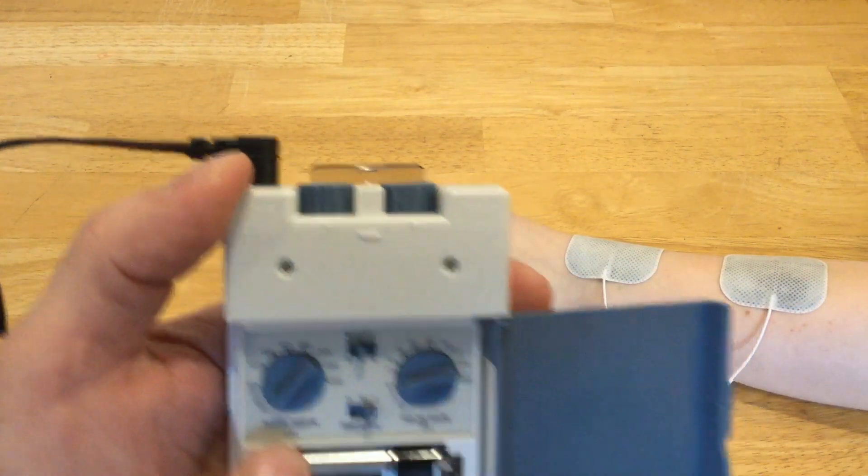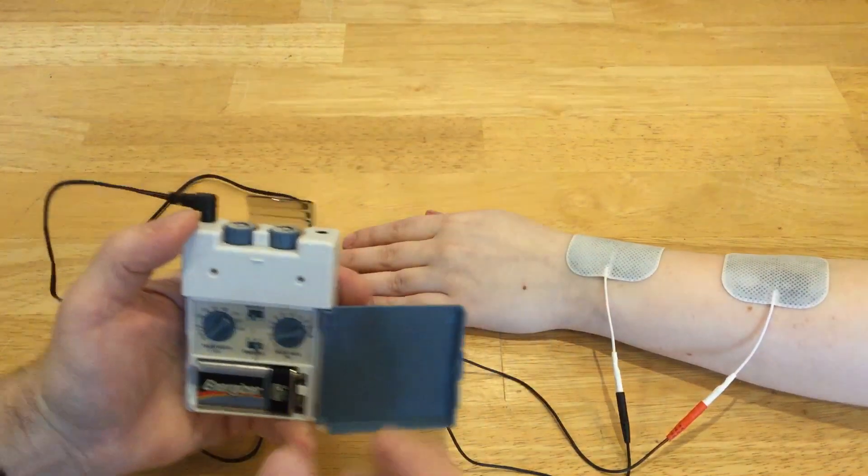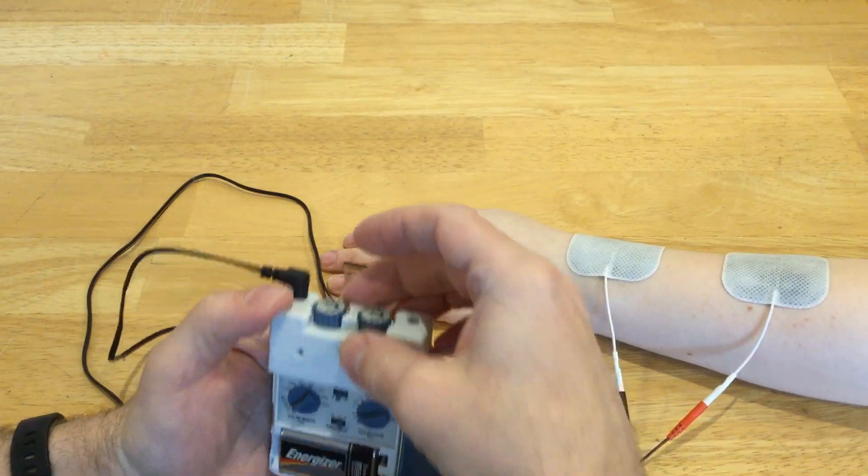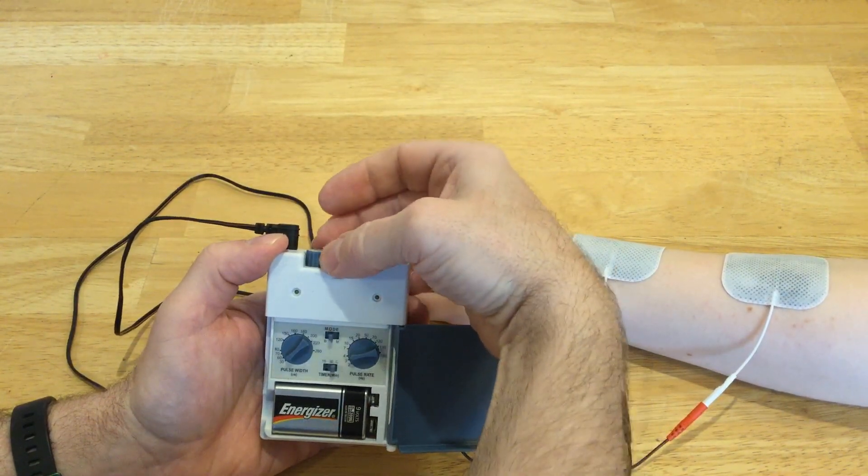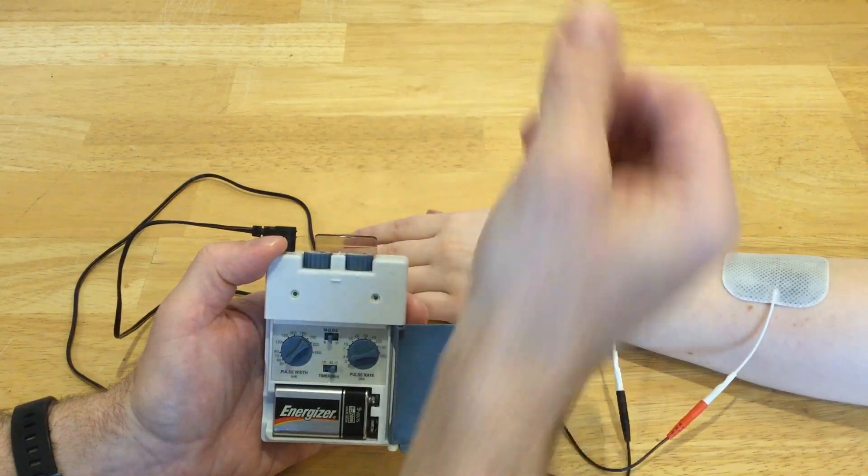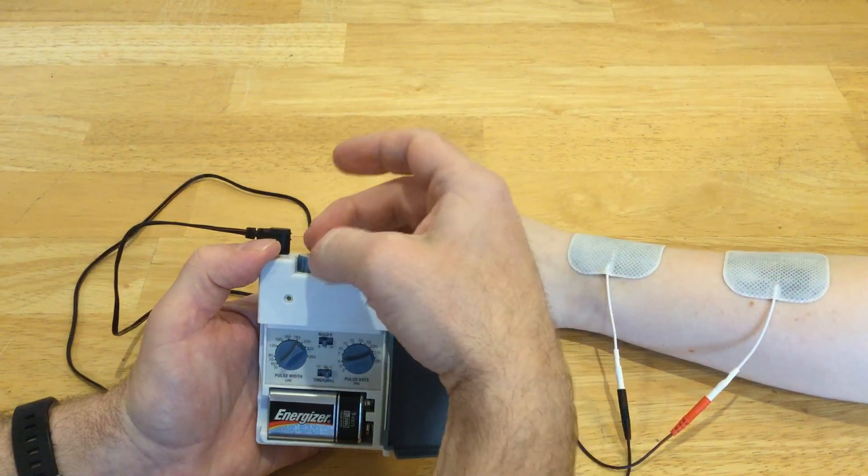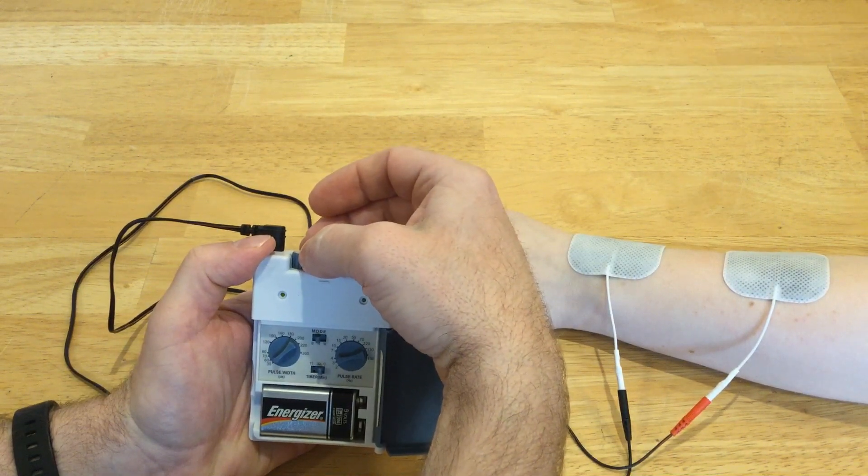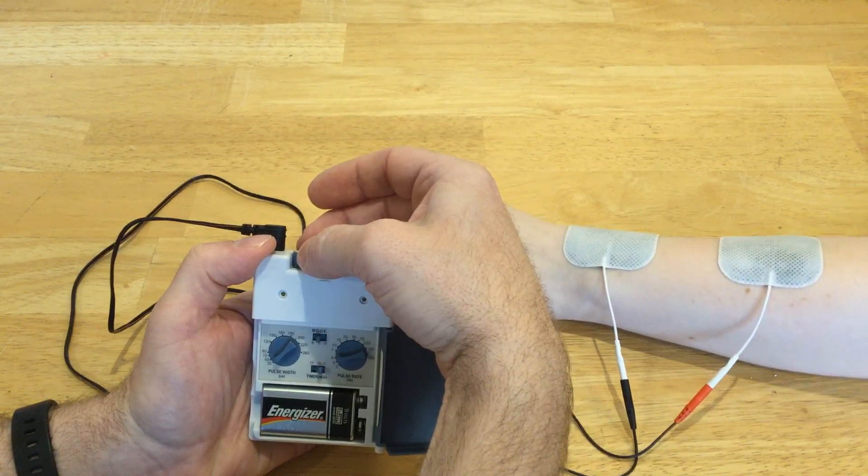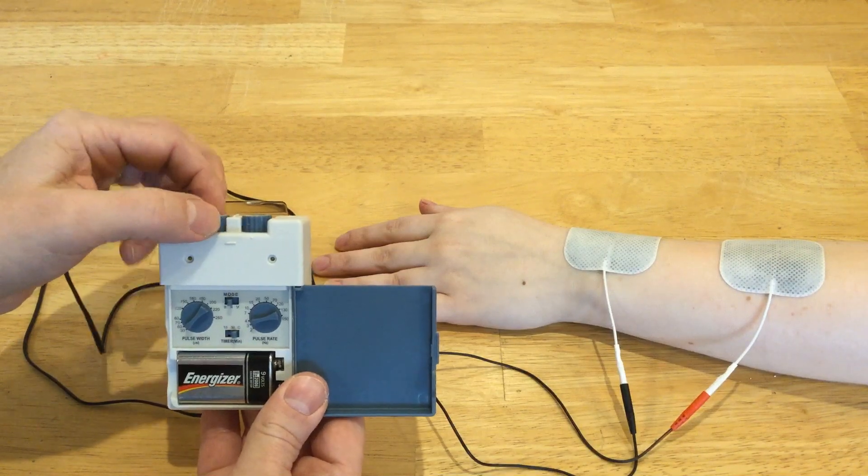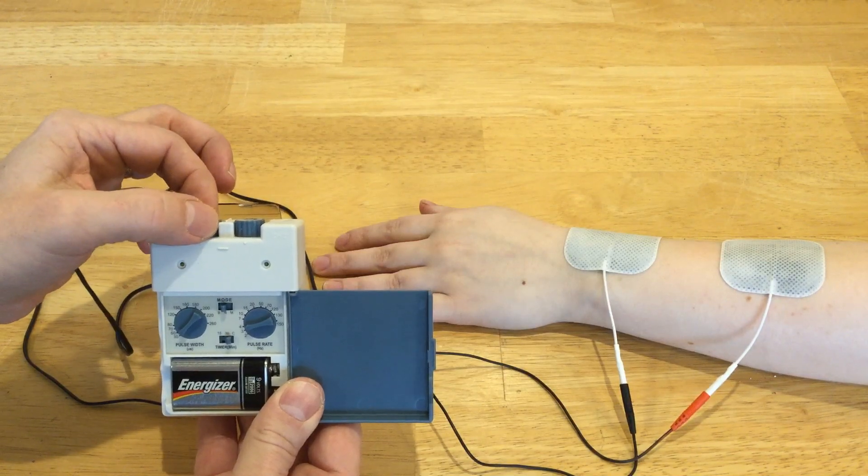So initially, I have my pulse width set really low. It's about 30 microseconds, so that's a really short pulse duration. If you look at your strength duration curve, you'll see that with that pulse duration, it's going to be hard to hit the motor curve. Let's just turn on the intensity a little bit. I have the pulse rate or pulse frequency set at four hertz, four pulses per second, just for demonstration. Do you feel anything at this point? No. So without feeling anything, we're going to slowly increase the intensity. Just let me know when you feel something. I feel it.